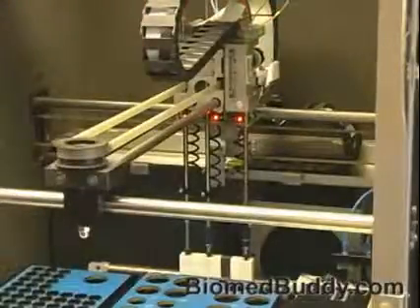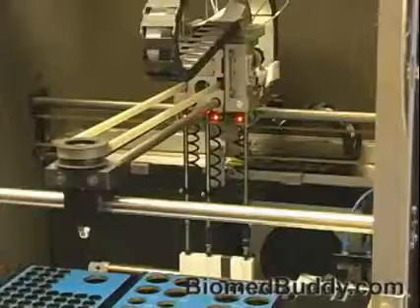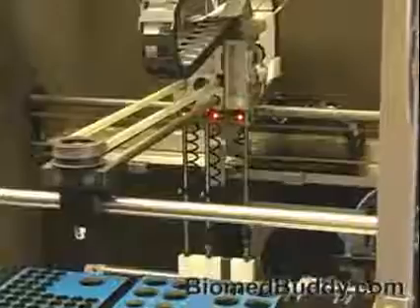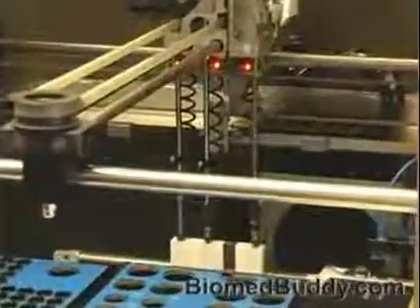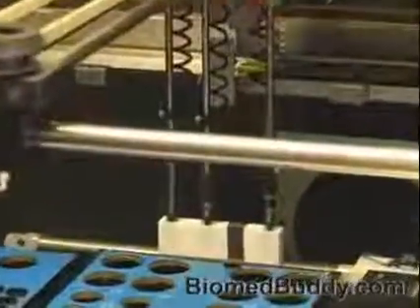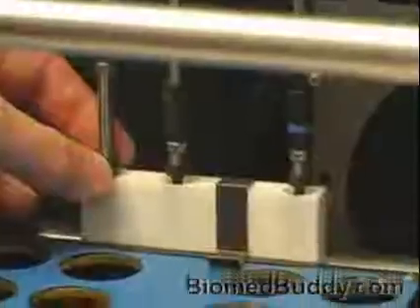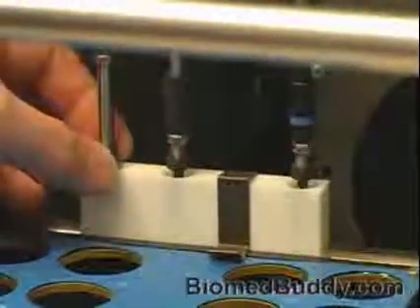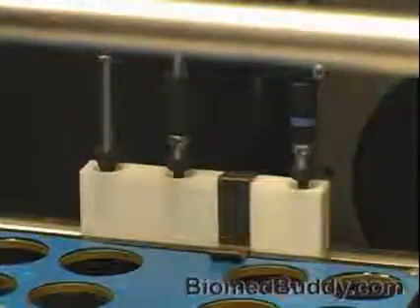Just a little distance. Again, this is what determines the mapping of the wash well, where the needles are going to go in the wash well, meaning center, and how deep the Z movement, how far down it's going to go. You can see from this you can't really overdo it. If you ever get a needle crashed into the wash well, it's either a BB in it or some other problem like the gear being loose or something along those lines.